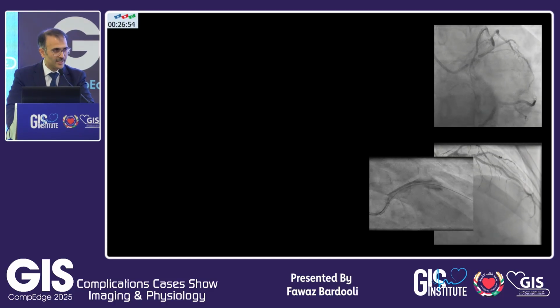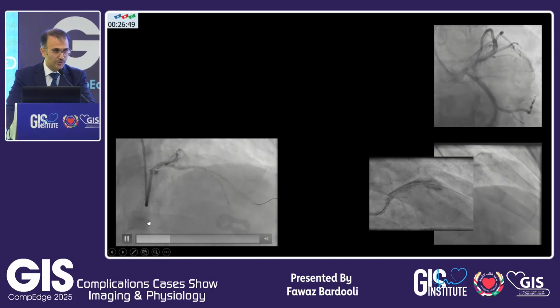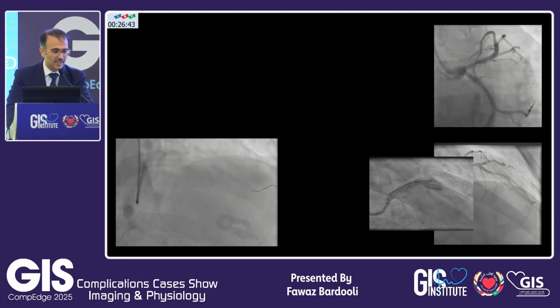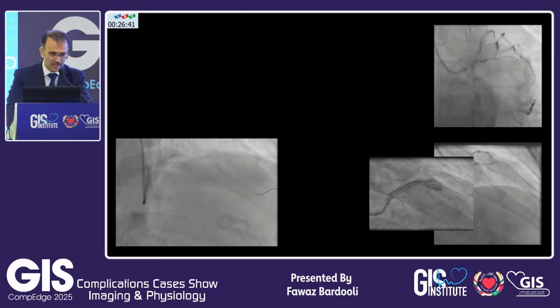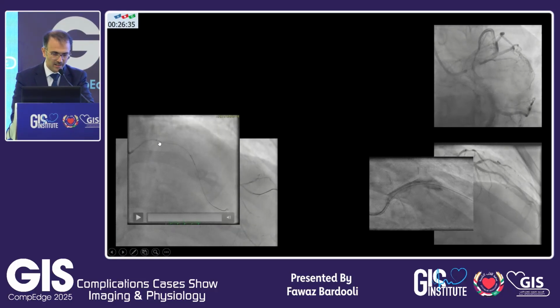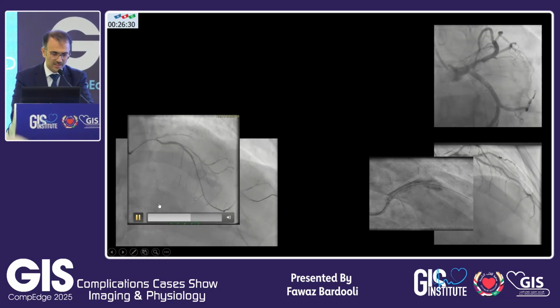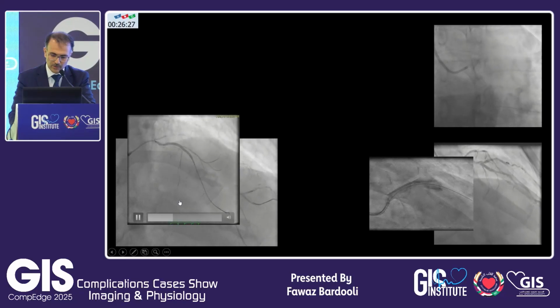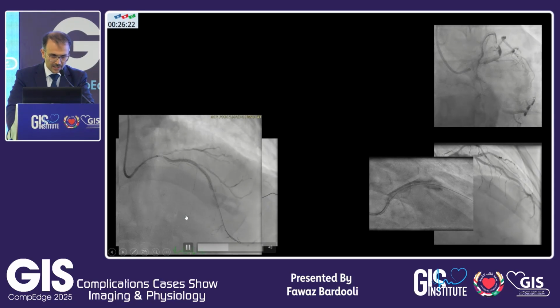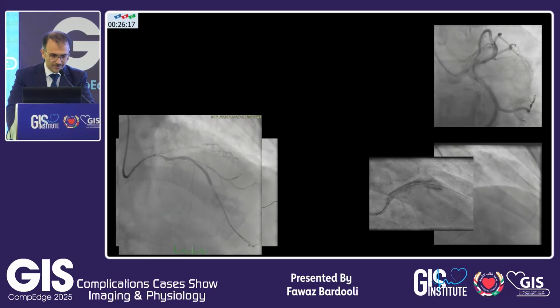Anyway, you said, let's carry on. You go here. This is a 3-vessel disease, refused by surgeon, MDT done, fix the RCA, fix the circumflex. He has this LAD lesion. You struggle with it so much to an extent that you see the guide is not supporting. You have a guide liner. You stented the proximal LAD, and you are having a lesion in the distal. You want to cover it with a stent. You put the stent, and this is immediately what happens after. And remember, I have a primary coming on the way. So that is not going to be my day.